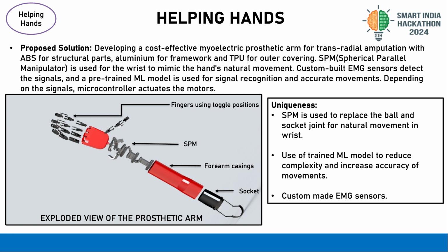The parallel architecture of an SPM offers superior control and accuracy, which is essential for the fine movements that are required by a hand. It also has lower energy consumption since each motor can work less compared to those present in a two-axis system. It's comparatively lightweight and more compact, and also more durable than other existing solutions.